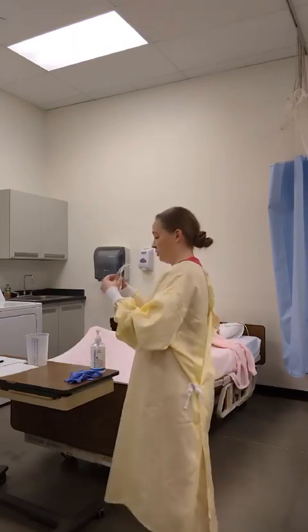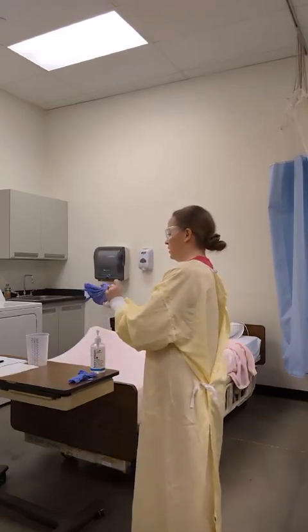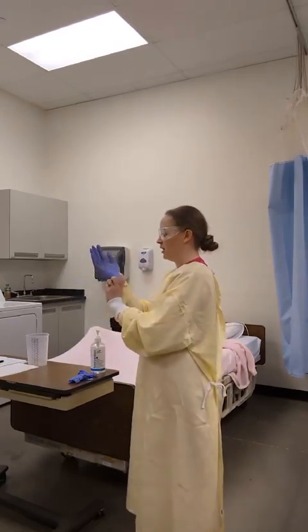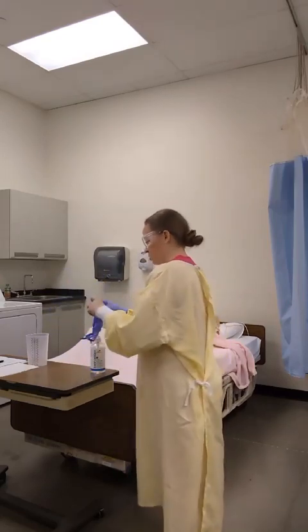I will put on my goggles and then my gloves, making sure that my gloves extend over my isolation gown.